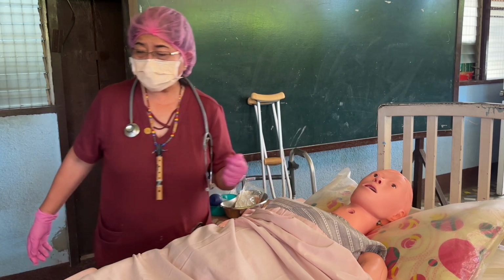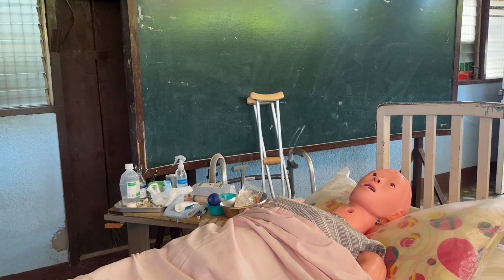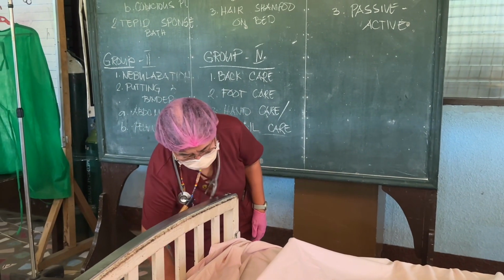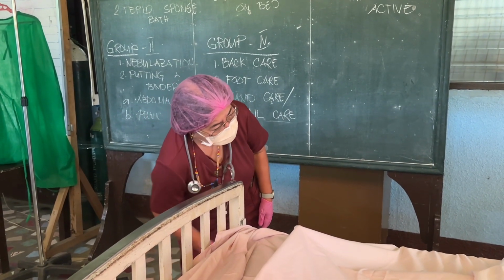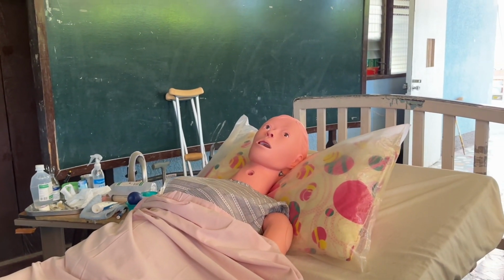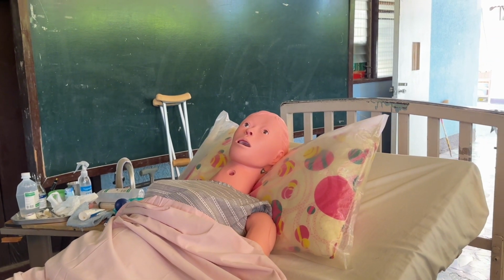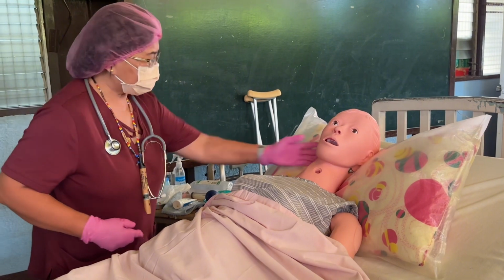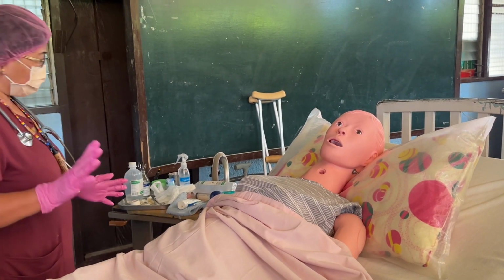And then, immediately, I'm going to adjust the backrest. Preferably, it should be a high backrest, but other patients cannot tolerate the high backrest, so I just put the patient in a moderate backrest. Okay, that's it. So, ma'am, I'm going to leave you first, ma'am.